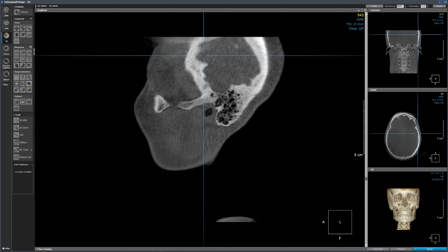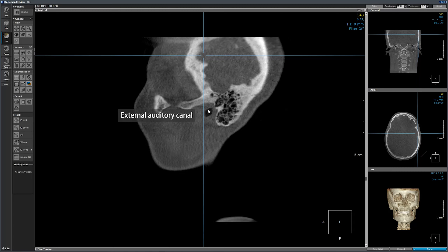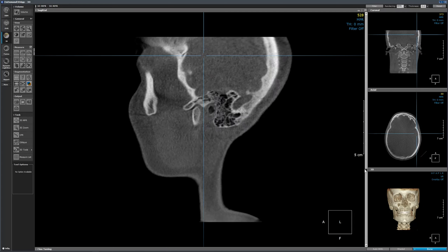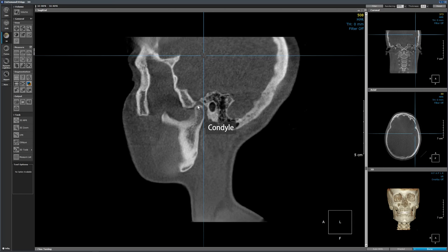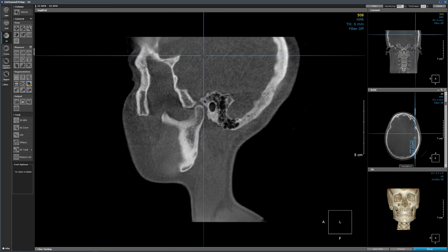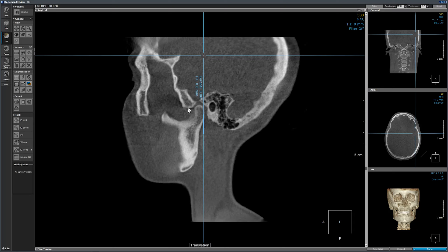Let's review a few landmarks on the sagittal sections. The crosshair is at the level of the left ear canal, so we are looking at the ear canal right here. This is the mastoid air cells. We picked up the condyle and the coronoid process. Looking at the reference crosshair, I know that this is the left condyle and left coronoid process. This is the external auditory canal. Between the condyle and the coronoid process, we have the sigmoid notch.